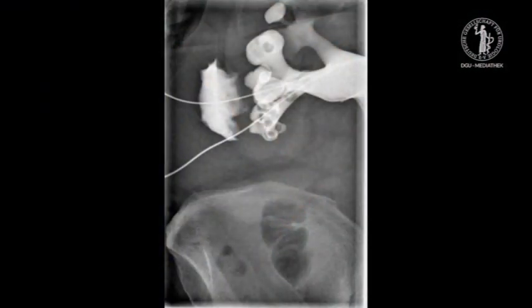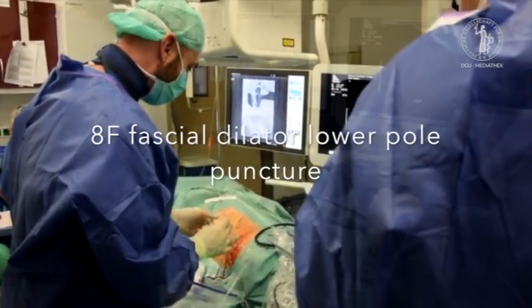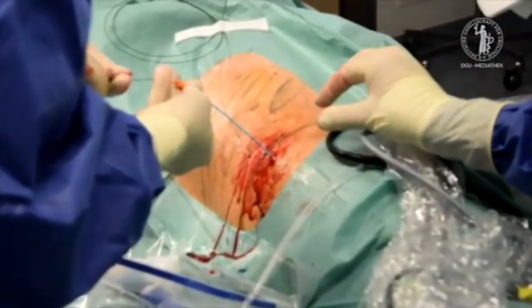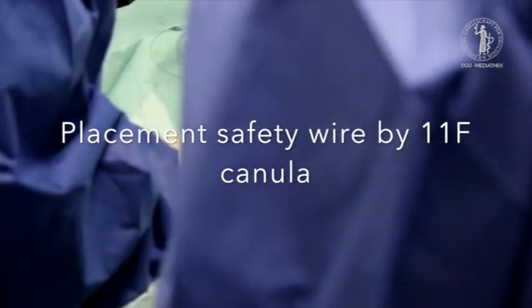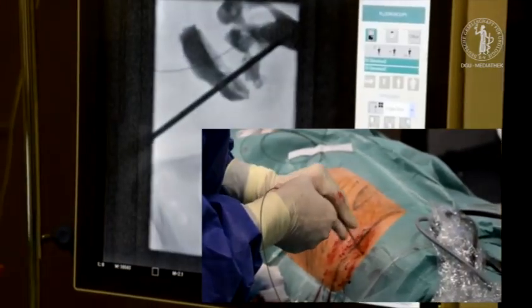The lower pole access is now used for the primary access and the fascia is dilated by an 8 French Teflon bougie over the guide wire. The next step is the introduction of an 11 French stainless steel cannula to place a second wire that stays as a safety wire.